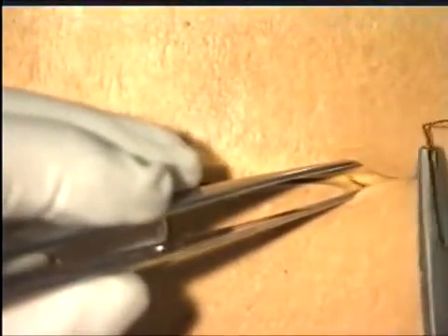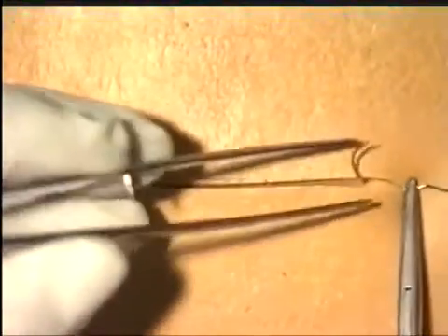Start the subcuticular suture by inserting a knot at the far end of the incision. Tie a standard reef knot and then cut the short end of the suture very short, as we're going to bury the knot.